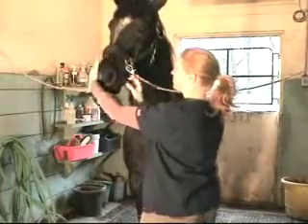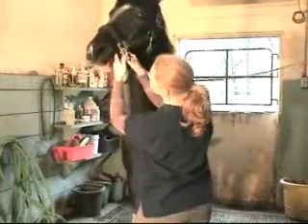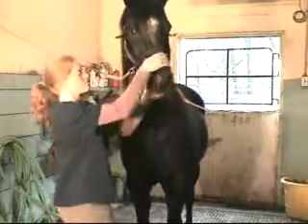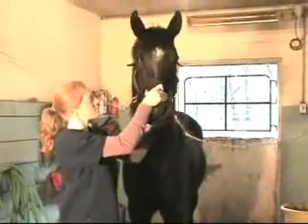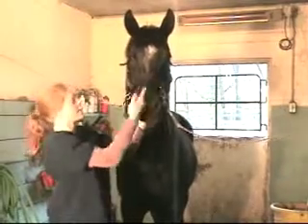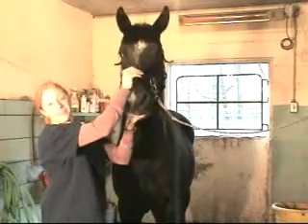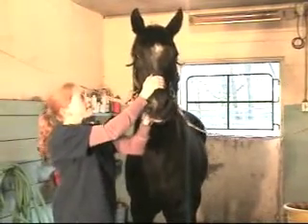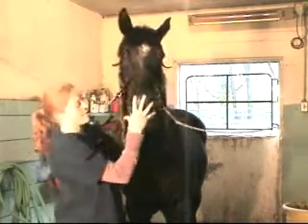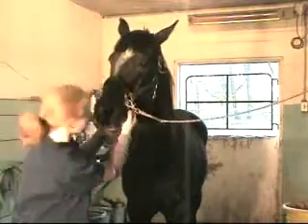So what we're seeing is Dr. Jennifer Campbell sedate Romeo in order to float his teeth. So we're trying to see if we have a side-to-side lateral excursion, and he doesn't really want to. Part of it he's fighting me, part of it he is getting caught, so his points are catching, and he doesn't have a very good side-to-side motion, which is what they need to eat well.